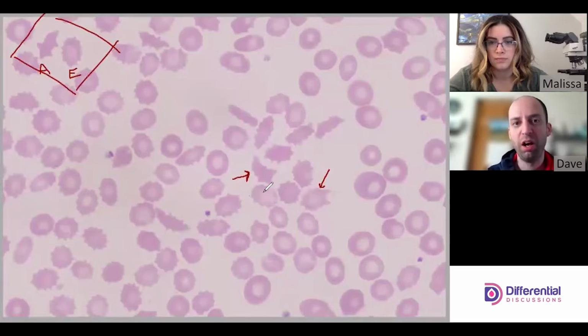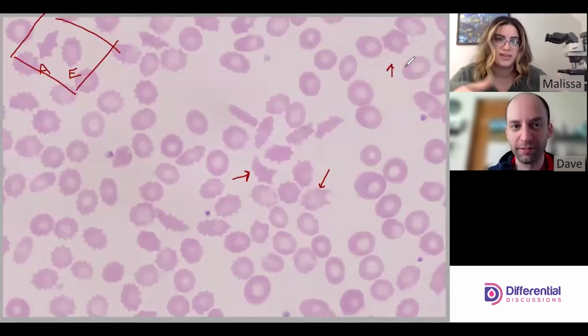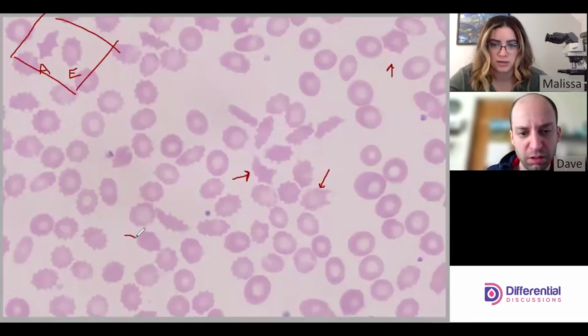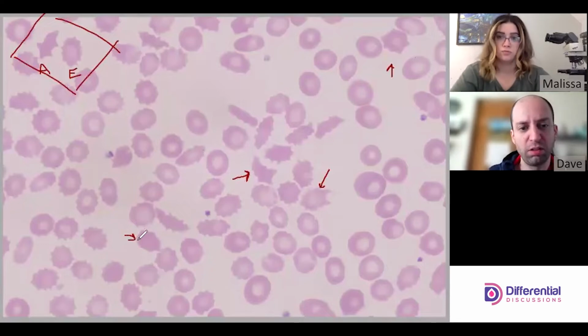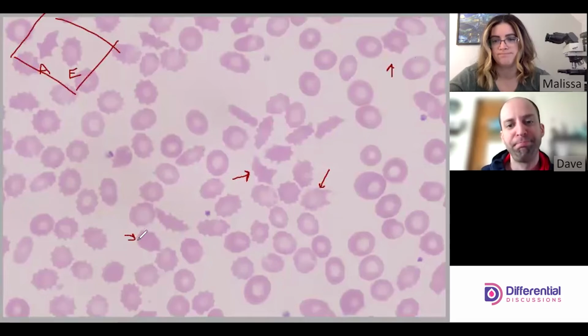And then, top right, this one? Maybe. I think so, because you can see a flat area here, and then a spike, and then a flat area. Weird looking other spikes, but it's not even-ish. You can see where there are too many spaces in between. Most others would broadly be echinocytes to my eye. Maybe this guy here is another acanthocyte. For picking out the really prominent acanthocytes, we picked those out.